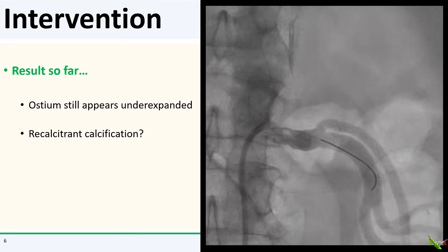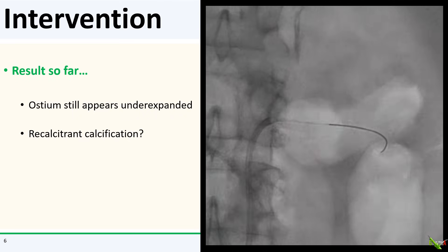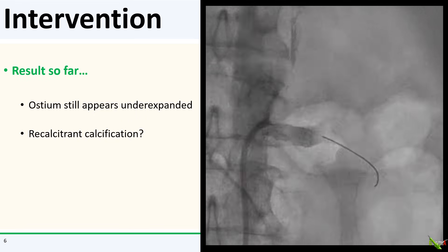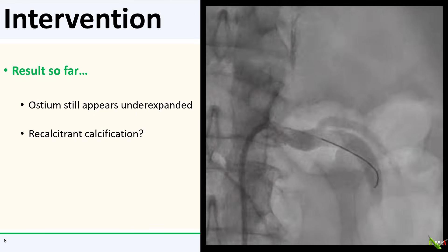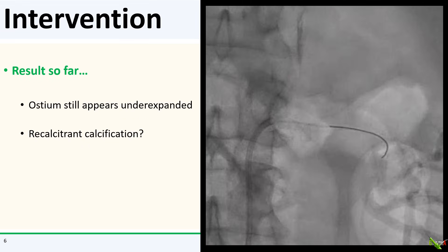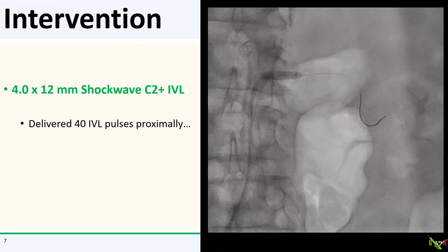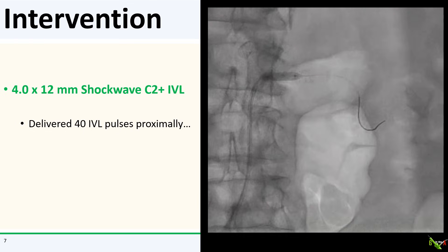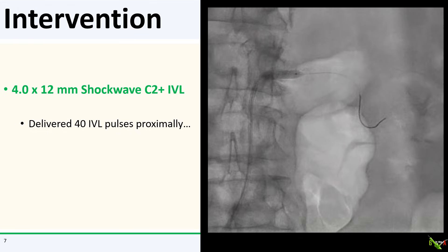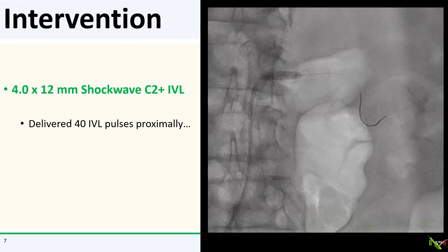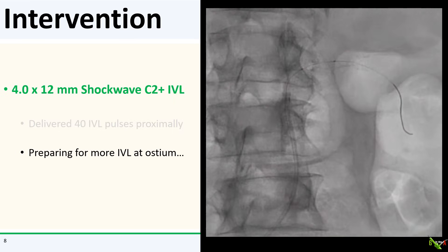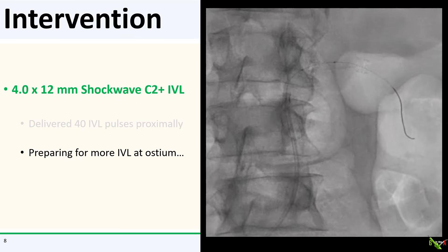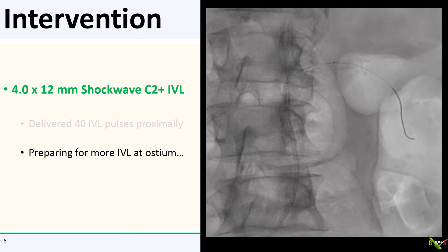Here is the angio after post-dilation. The left renal artery overall looks better. The mid and distal parts of the stent look pretty good, but the ostium still looks a bit underexpanded, possibly due to some degree of calcification there. So it was decided to proceed with intravascular lithotripsy. A 4.0 by 12-millimeter shockwave IVL balloon advanced very easily into the proximal segment of the stent, and 40 pulses were delivered. The shockwave IVL balloon was then pulled back to the ostium to deliver more pulses, and here is the fluoro image showing the balloon position.